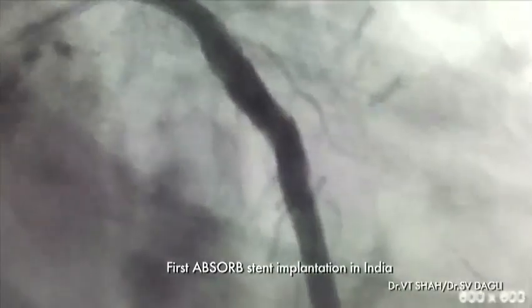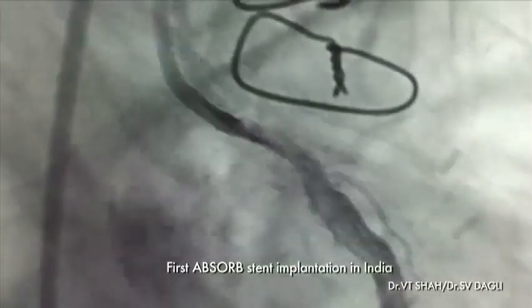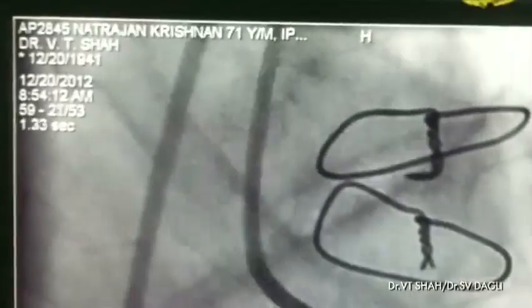This is the final picture on the circumflex side. As you see, it's a big artery and a large size Absorb stent was deployed in this.